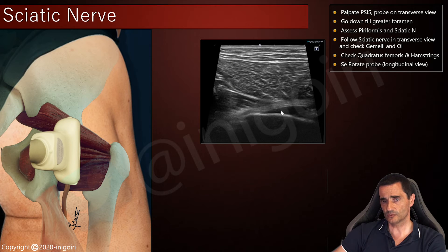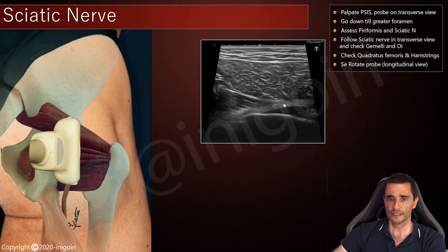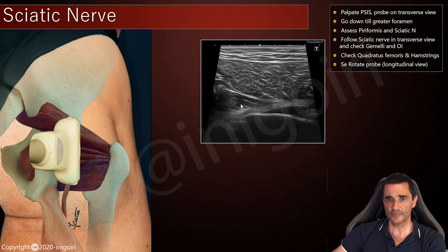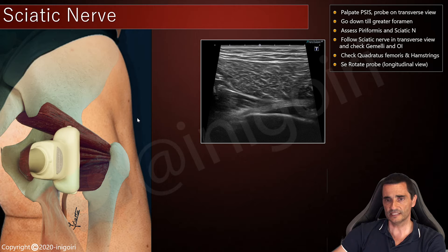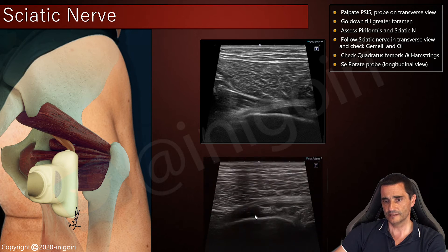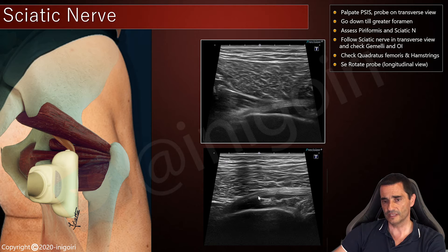If we turn the probe 90 degrees over the nerve, we will notice this fascicular pattern very clearly. This is cranial, this is distal. We can see how the sciatic nerve goes intrapelvic below this muscle — this will be the piriformis muscle on its transverse view. This is the superior gemelus, and this is the tendon of the obturator internus. Going slightly distal following the path of the nerve, this is a better image of the rotators of the hip: the superior gemelus, inferior gemelus, and between them the obturator internus — and this is the sciatic nerve below the gluteus maximus.